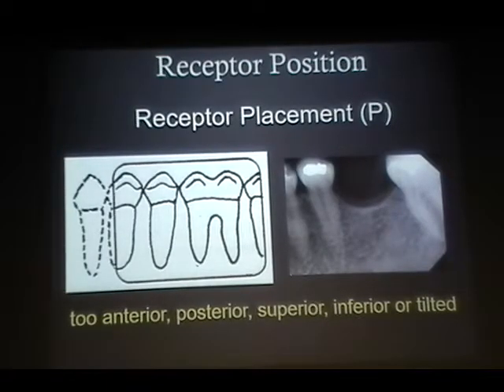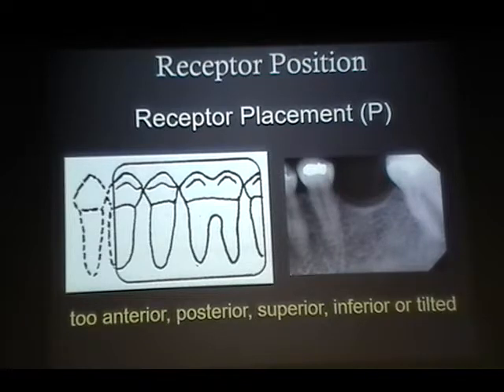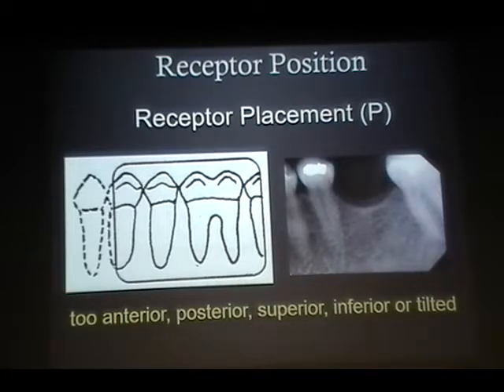If you look at this particular image, what is happening here is it is not appropriately positioned, right? If you are trying to capture a lateral canine view, here the canine is missing because the receptor is positioned much more posterior. You have to make sure that you capture the canine, at least the distal of the canine, because in other views, you are not going to capture it. The correction that you have to do is bring the sensor more anterior.